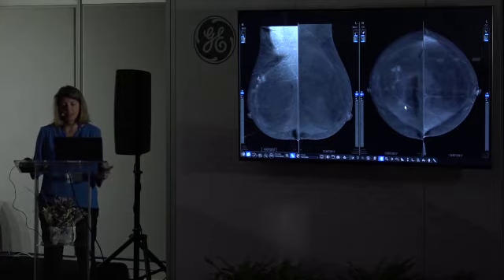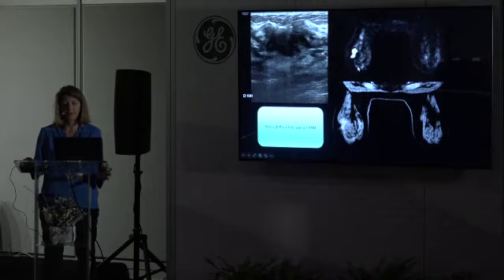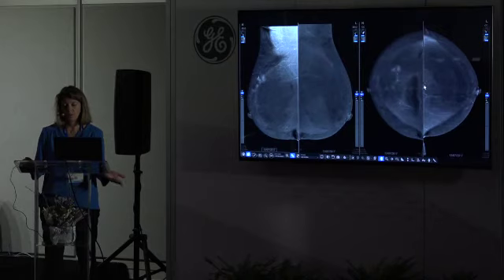And in this case, what is interesting is to compare with MRI. And this is the MRI. Finally, the lesion was seen on diffusion. But we know that sometimes on breast diffusion, lesions are quite distorted. It was clearly not really visible after contrast injection because the background enhancement was very high on this MRI. And when we compare with the contrast mammography, we don't have a very intense background enhancement.